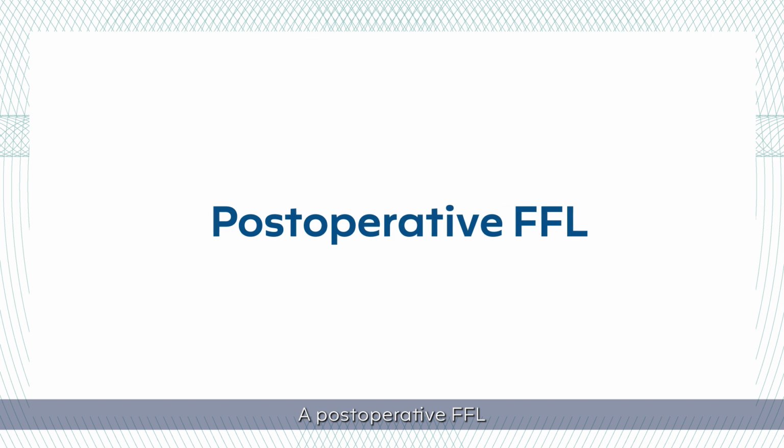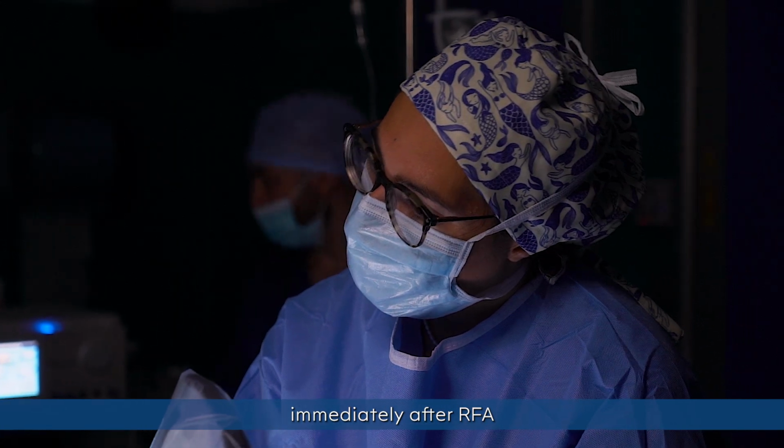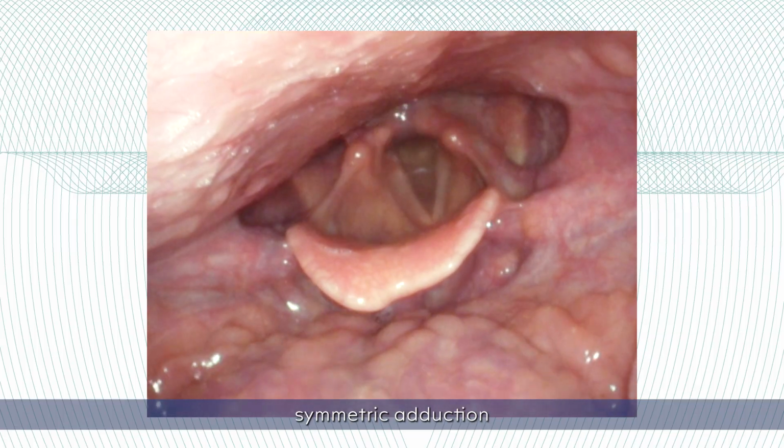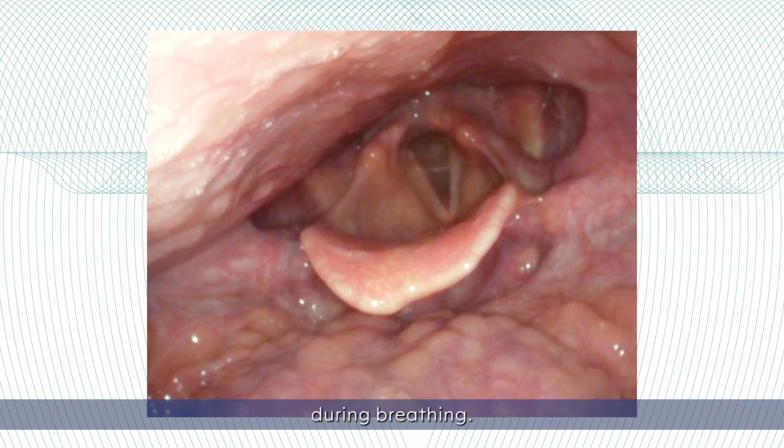A post-operative FFL is performed on conscious patient immediately after RFA in order to confirm normal vocal cord symmetric adduction during phonation and abduction during breathing.